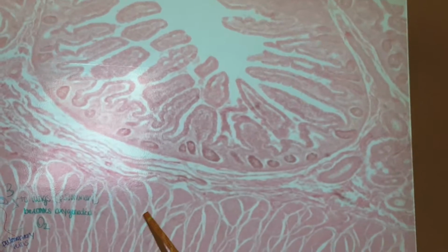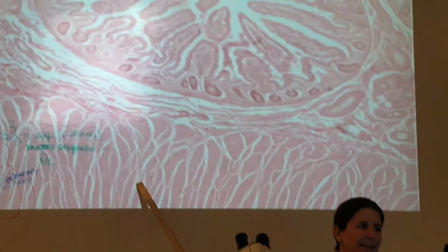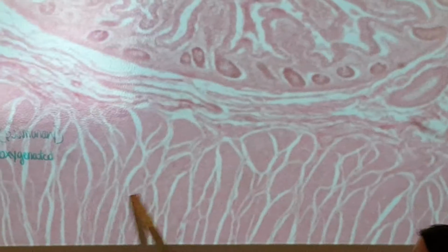So since we're right here, what kind of muscularis externa is this? Circular. Unfortunately circular. It's always the one after it. I know. You're like, what? You just told me it was supposed to be this way. No. This is awful.